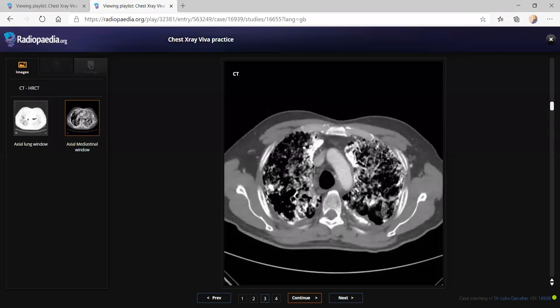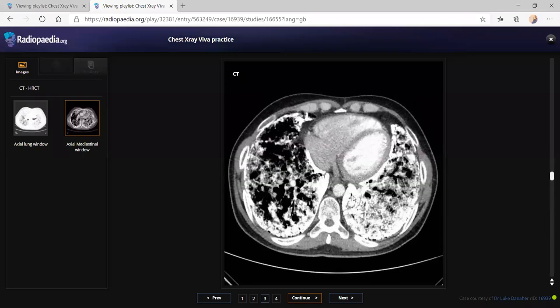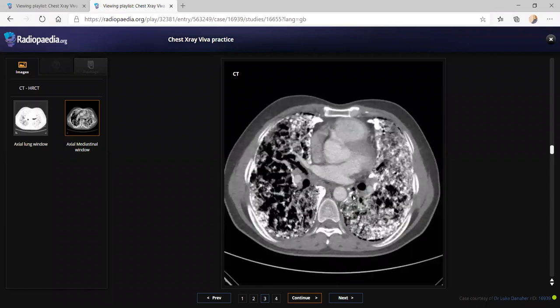Okay. So the post-contrast images show hyperdense areas in both lungs. So I'll be comparing with the plain images also to confirm that these are dense calcifications slash ossification. Plain to confirm this? Not really. Do you want to give another radiation for the patient? No, because the X-ray was also showing hyperdense areas. I'll take it for granted that this is having calcific or ossific density. So this is a case of pulmonary ossification or osseous metaplasia of lungs.